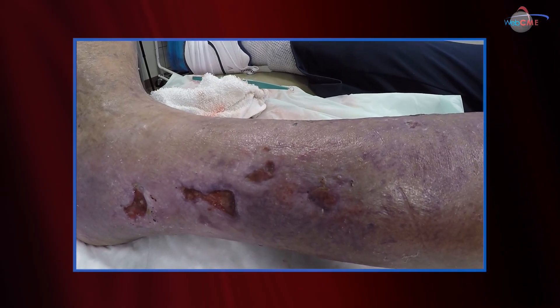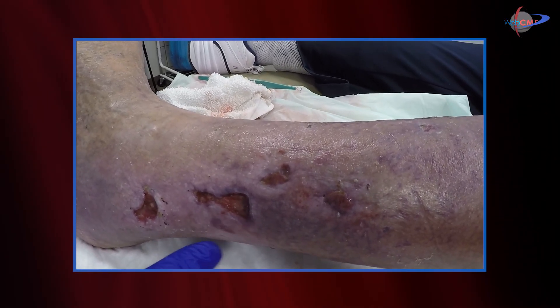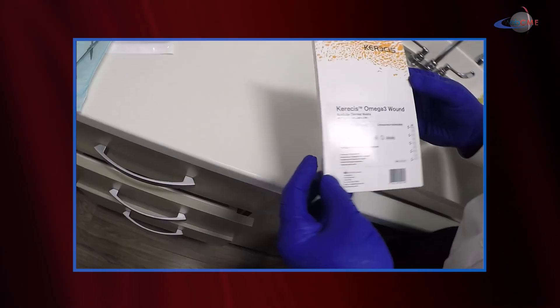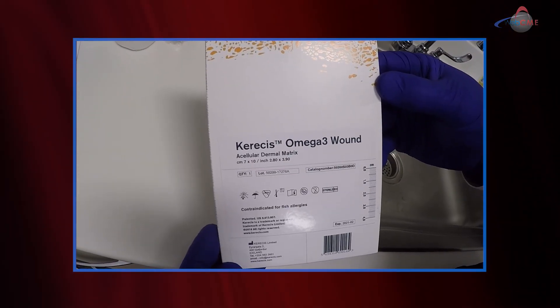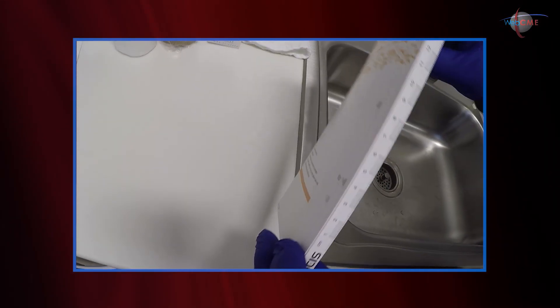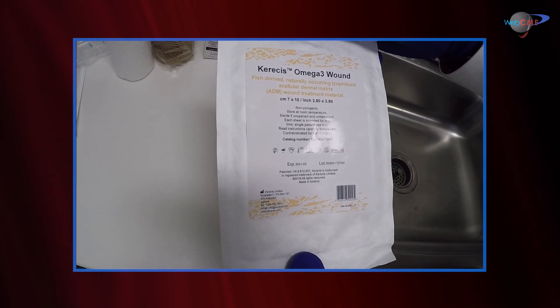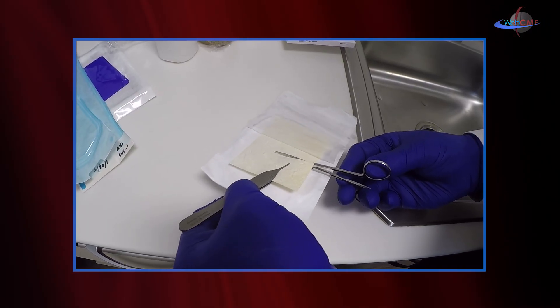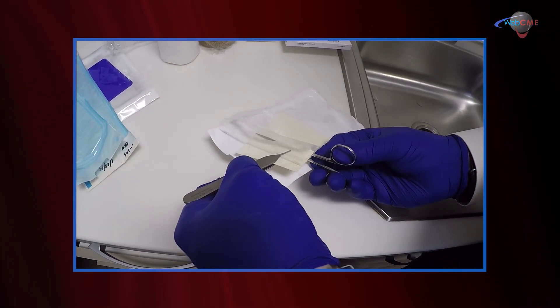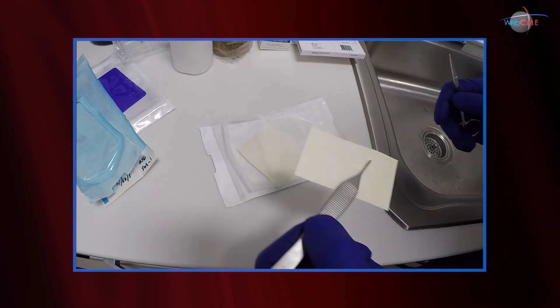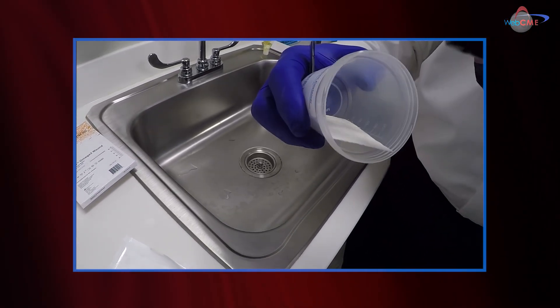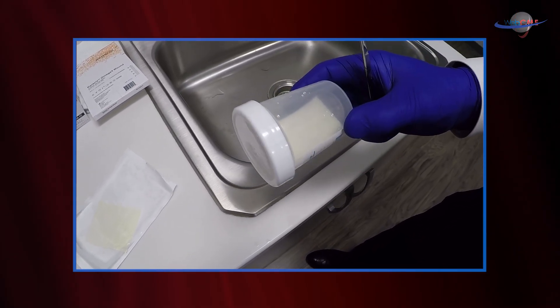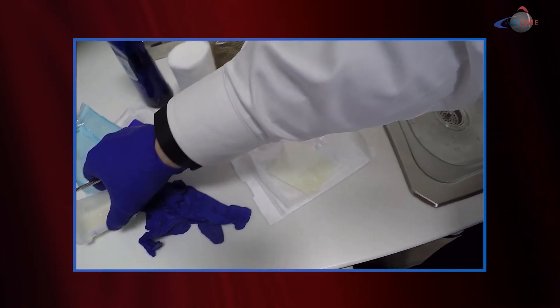We're going to put the patient back in compression. He did report significant improvement in his pain after the application of the graft, which is always nice to see. We're using the Caceres Omega 3 wound dermal matrix. This is a 7 by 10 centimeter graft — we're not going to need all of that fortunately. I think this will be enough graft to cover all the wounds. I am going to hydrate this, as the graft is a little easier to apply in a moist state. You can apply it dry if you wish, but I like using it moist.